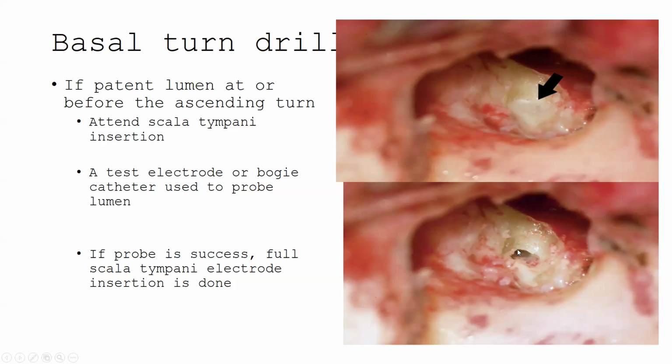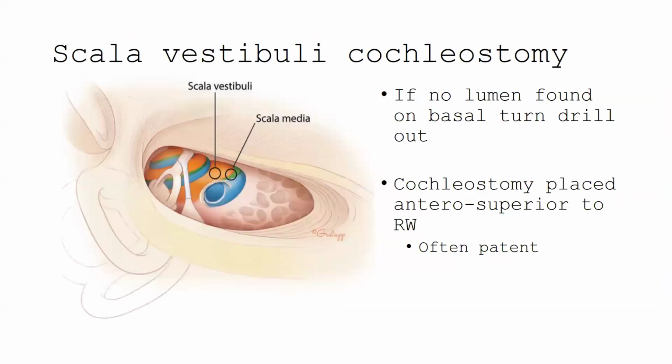Important as we insert the electrode is to ensure that we are not forcing it in, as this will just lead to rollover of the electrode. Some studies report inserting the electrode and leaving the stylet in to try and give rigidity to the electrode, but the results are variable for leaving the stylet in.